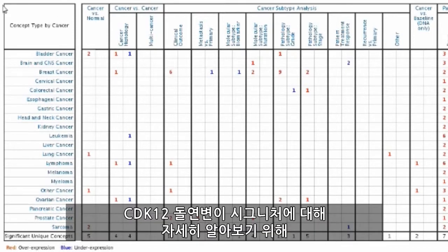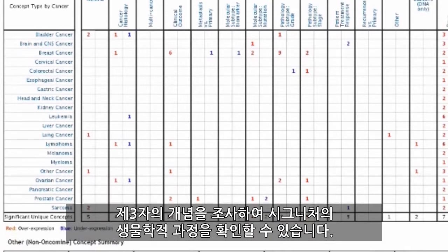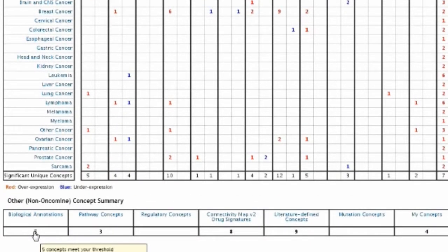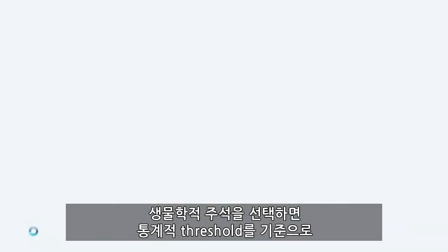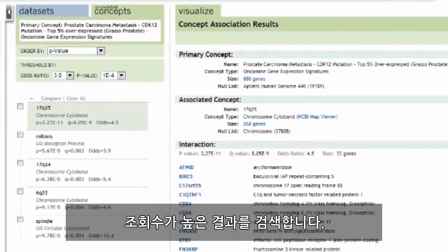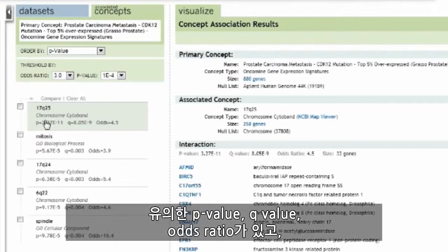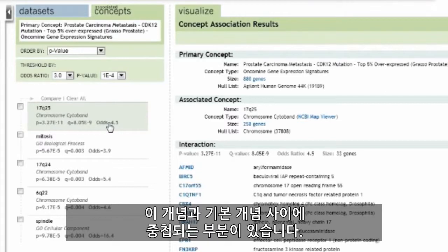To understand more about the CDK12 mutation signature, we can investigate third-party concepts to determine the biology of the signature. By selecting biological annotations, we retrieve hits based on our statistical threshold. The number one hit, chromosome 17Q25 chromosome cytoband, has a significant p-value, q-value, and odds ratio for the overlap between this concept and our primary concept.